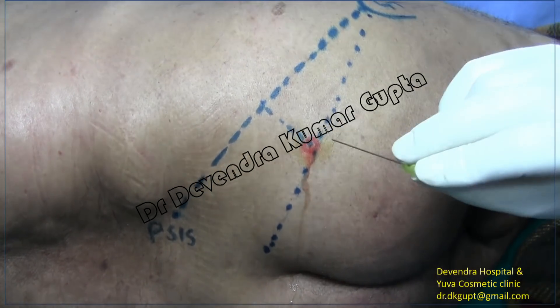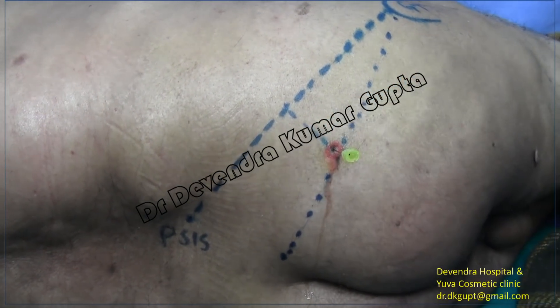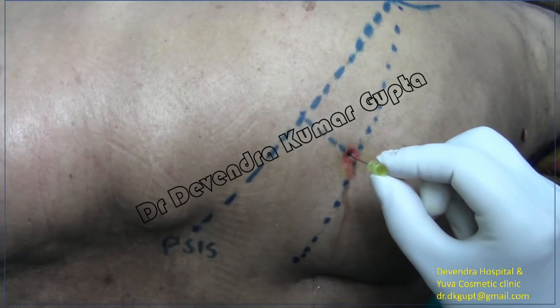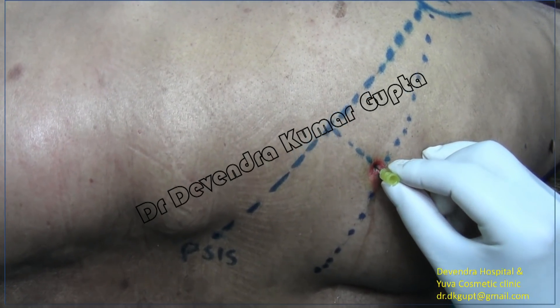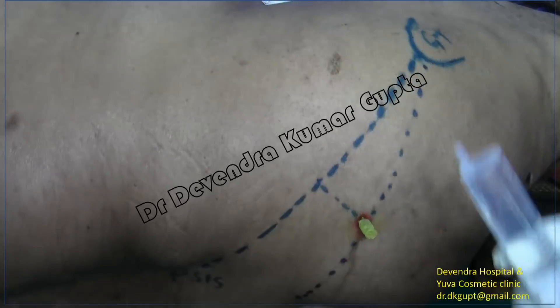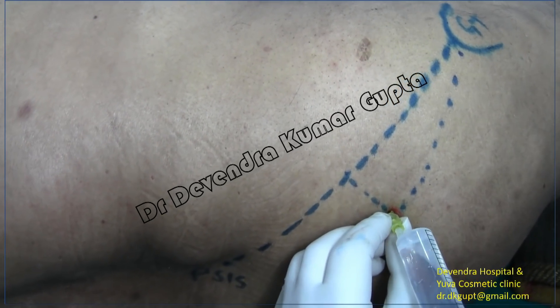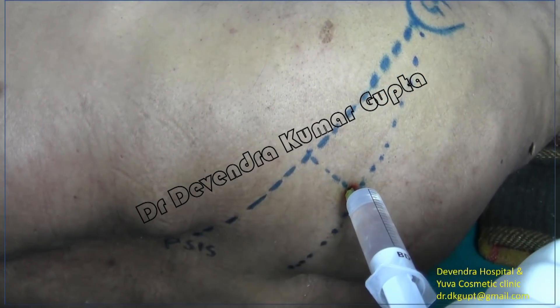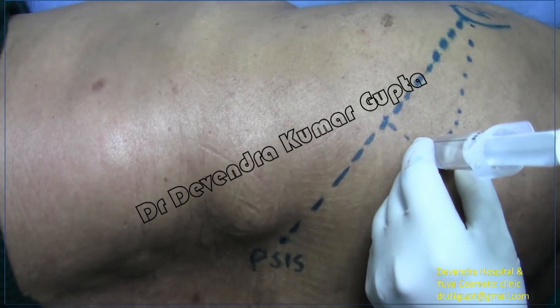A 10 centimeter long needle is passed through the same anesthetized point, going directly deep in the perpendicular plane in all directions without tilting the needle. At depth, it should strike the bone. I have taken 20 ml of the mixed anesthetic solution. The needle tip is now striking the bone. Load the syringe and make sure to check if there is any blood in the syringe — there is none.